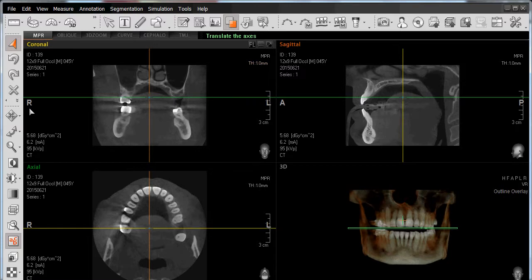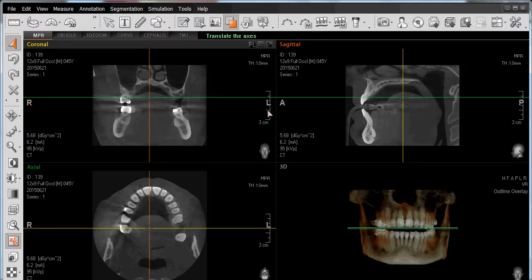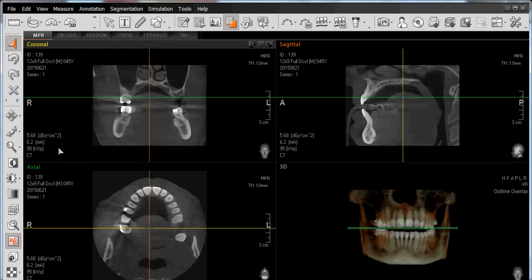We also have our anatomical markers — in this case here, right and left — as well as our patient orientation, in this case here identifying an anterior-posterior aspect. In the bottom left-hand corner, we then have our radiation dosage as it relates to the exposure for this particular scan.